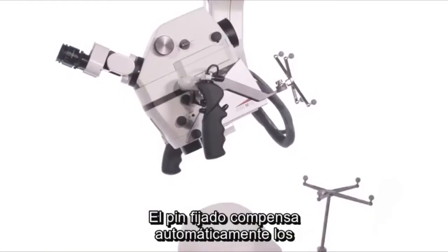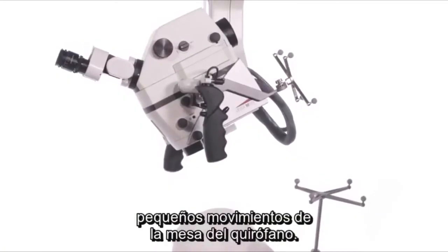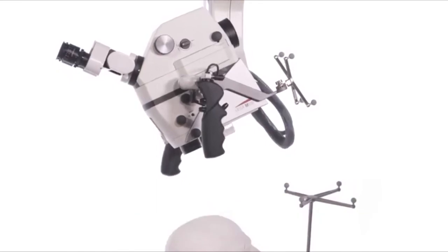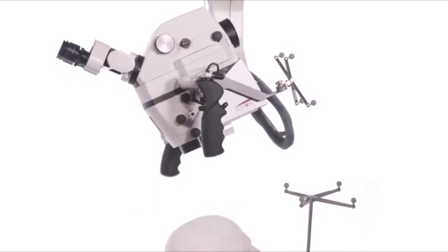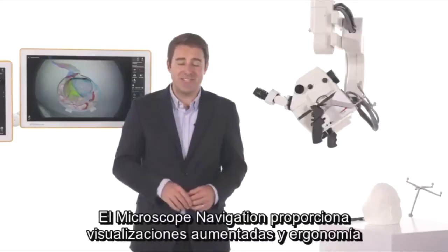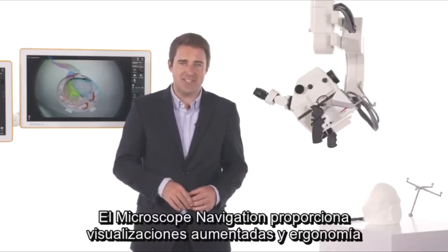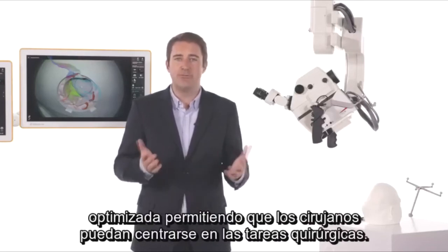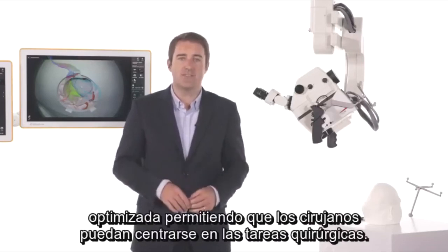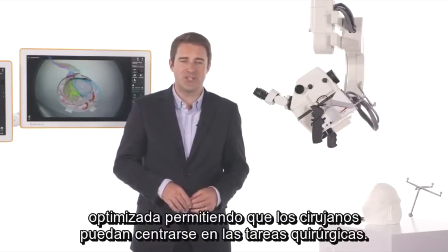Stay-on pin automatically compensates for small movements of the OR table. Microscope navigation delivers augmented visualizations and improved ergonomics, allowing surgeons to stay focused on the surgical task.